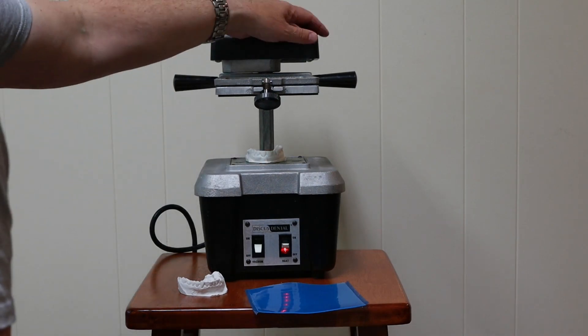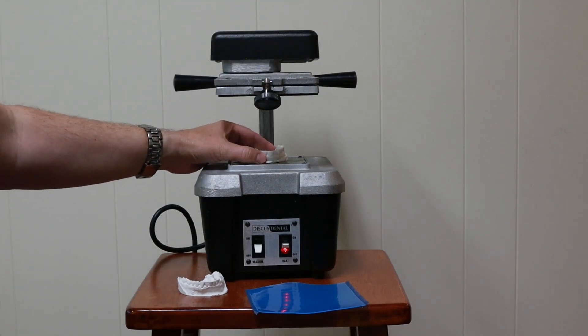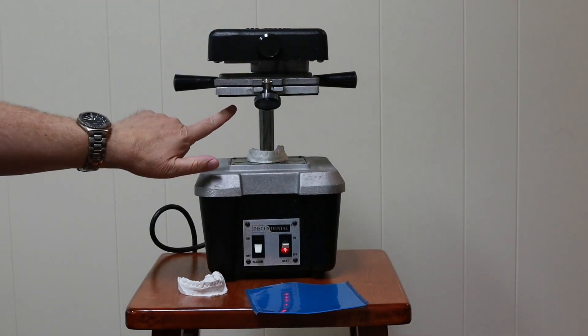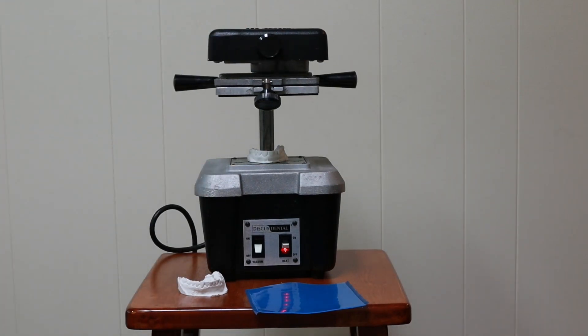Let's put the tray there. Let's put the model here. Let's rotate the heating element. And now we're just going to wait for the material to start to sag. I like to see about an inch sag and then I know it's sufficiently warm enough to vacuum form.